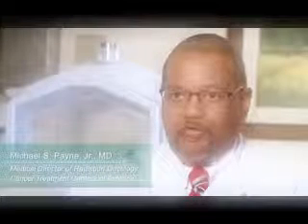What CyberKnife is actually a number of beams, anywhere from 50 to 300 individual beams that converge on the cancer and give high doses of radiation to the cancer, but very low doses to the surrounding structures. Radiation oncologists will look at the patient's records to determine whether they're a CyberKnife candidate. If they are, then the patient goes on to see a pulmonologist.